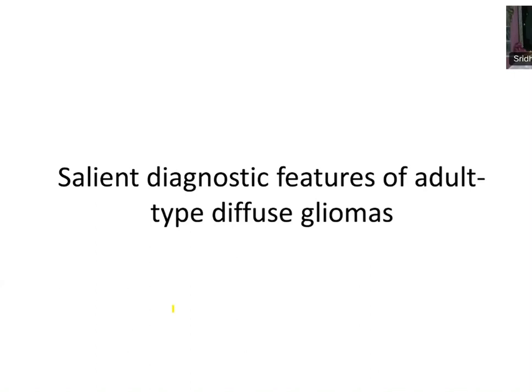Because it's a mutation. The mutation caused the tumor. This is the tumor driver mutation. It will be present in all tumor cells. It cannot be present in only some cells. In glioma, IDH mutation is a driver mutation for tumorigenesis, both for astrocytic and oligodendroglial tumors. You cannot have some cells positive and some cells negative. When you see positive cells with some negative cells, probably the negative cells are not abnormal cells, they might be reactive cells.